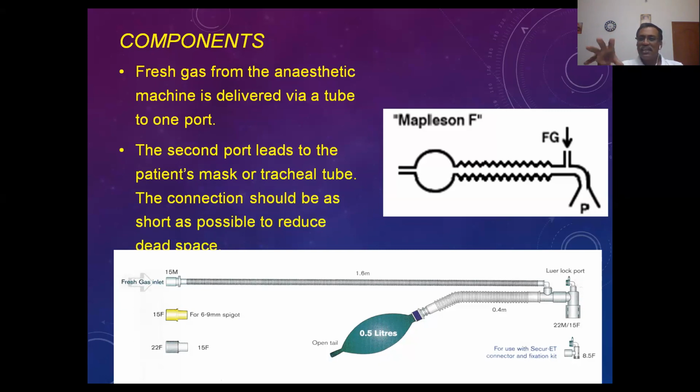But in a standard adult, we calculate it as 150 ml, provided the patient has a tidal volume of 500 ml. Okay. And if the examiner asks you what is the dead space volume in a patient, you should not say 150 ml, the examiner will be irritated. You can answer smartly as 2 to 3 ml per kg. 2 ml per kg, that is enough. Okay.